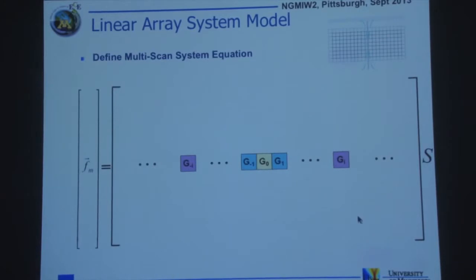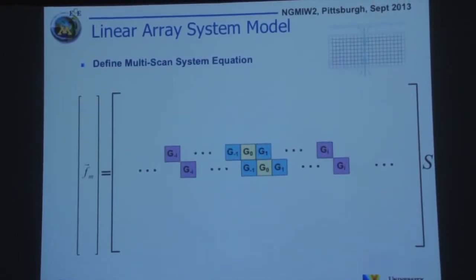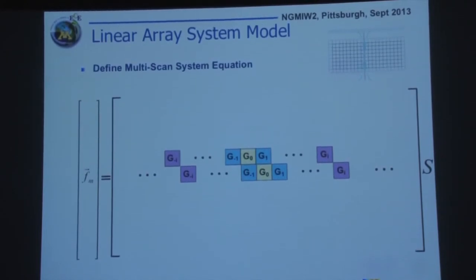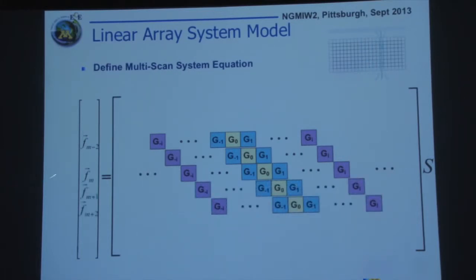Form a matrix equation that basically accounts for every grid point on the imaging grid. As you can see, as the beam moves... I'm trying to make it move. Okay, so every line of the image has a large matrix, as you can see, that forms this relationship between the scattering and the received data vectors from every beam.